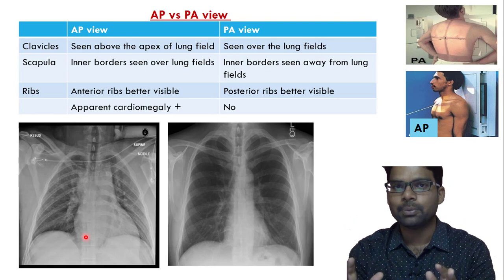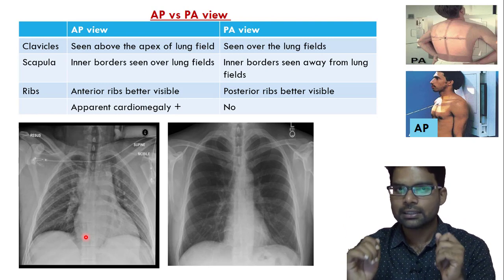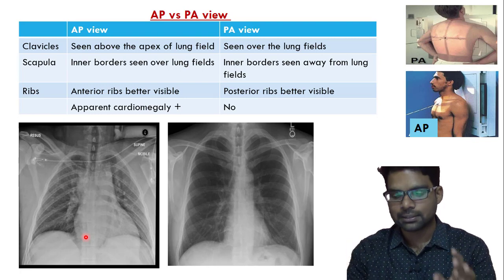These are the four basic differences between AP film and PA film. When given an X-ray, you must be able to identify whether it is PA or AP. Now let us look at normal radiological anatomy - the different structures visible in a chest X-ray. When someone gives you a chest X-ray, it is not only about the lungs or the heart; there are many structures visible, starting from skin going inside to the heart.